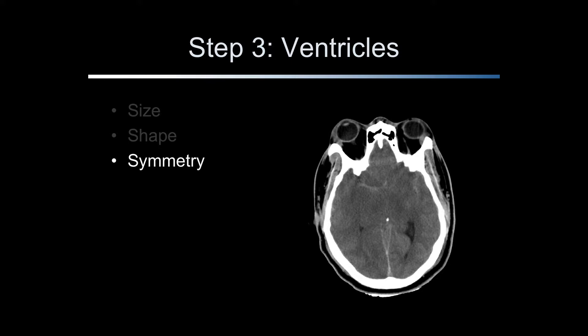Asymmetric ventricles may be a clue to a mass or edema. The reader must also recognize if the patient's head is not square in the CT scanner. This patient has asymmetric posterior horns of the lateral ventricles, as shown by the blue arrows. The third ventricle is also compressed, or effaced, as it should be seen in the same cut as the pineal gland, shown here by the yellow arrow. These effects are due to a large subdural hematoma seen on more superior slices.